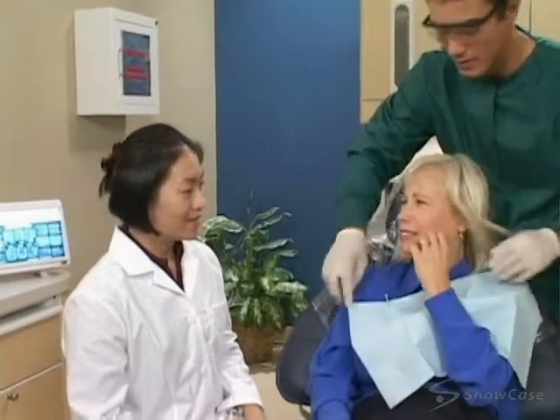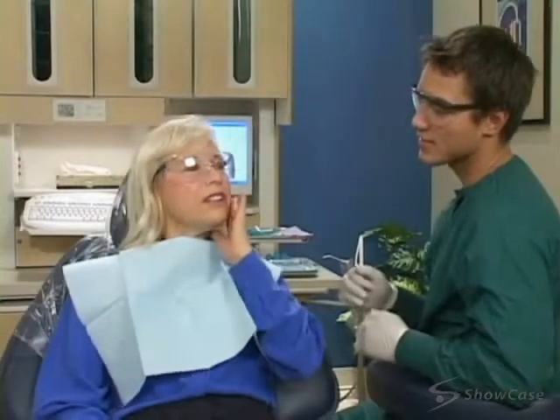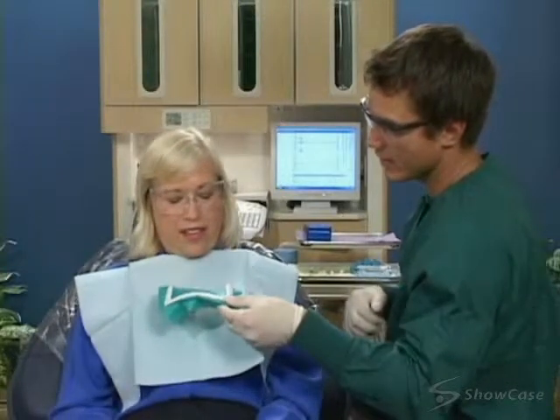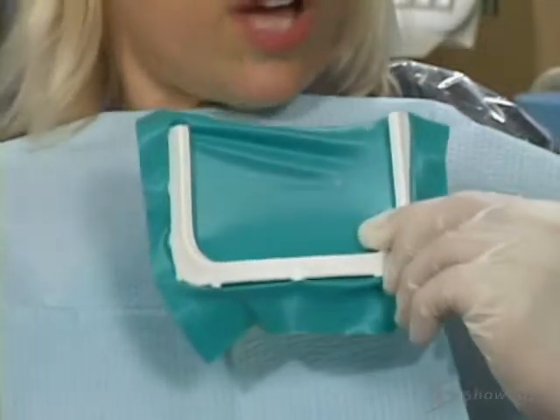When the pulp layer of a tooth is infected, we recommend root canal therapy. We start the procedure by numbing the area to make you comfortable. We may also use a rubber dam to protect your mouth and ensure that nothing falls to the back of your throat while we work.